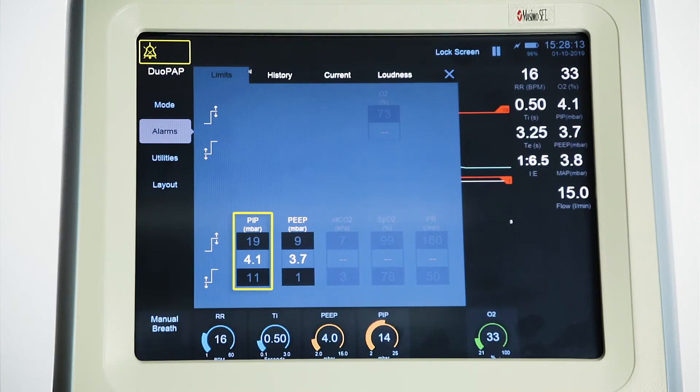Alarms include high and low PIP, high and low PEEP, which are auto-set and can be user-adjusted.